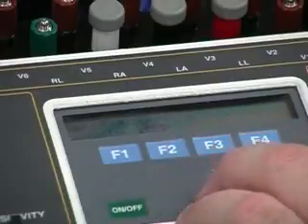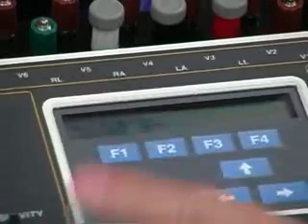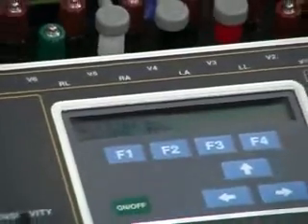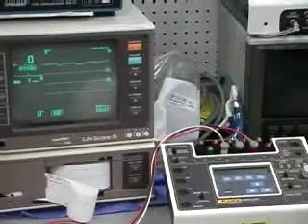Instead of having to say, okay, I want to do normal sinus for a while, now some PVCs, now some VTAC, now some VFib, and some asystole, just go to CCU or cardiac failure trend, and it will automatically loop those together for you.